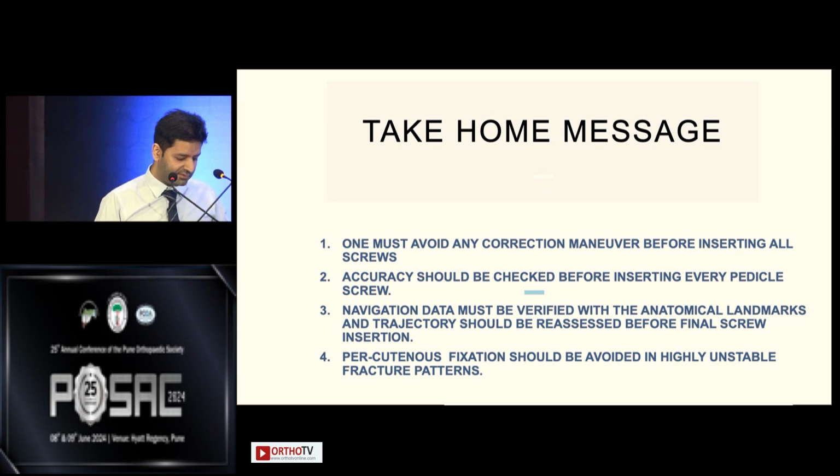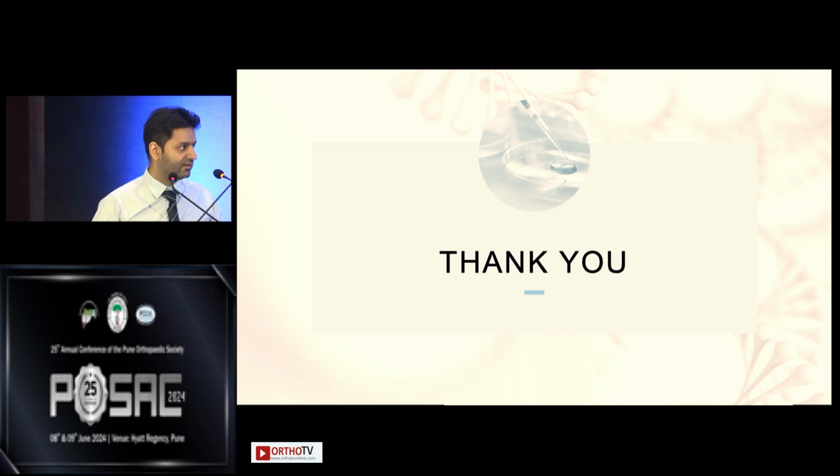So the take-home message is, one must avoid any correction maneuver before inserting all the pedicle screws. Accuracy should be checked before inserting every pedicle screw. We should always take more care in highly unstable fractures, and navigation data must be verified with anatomical landmarks. Percutaneous fixation should be avoided in unstable fractures. Thank you so much for your time.